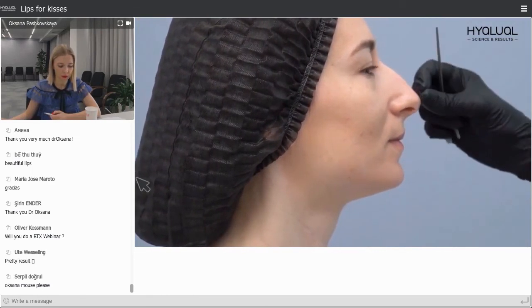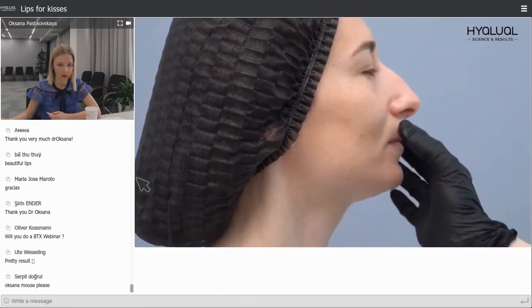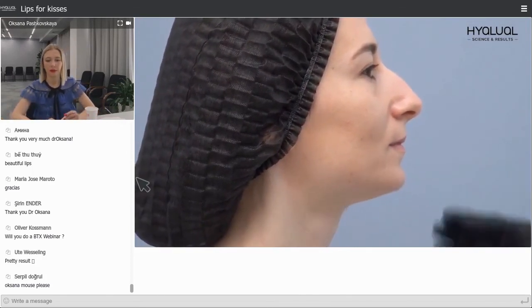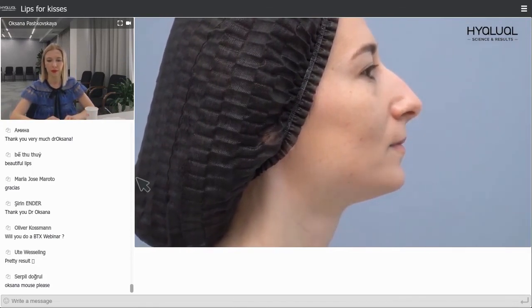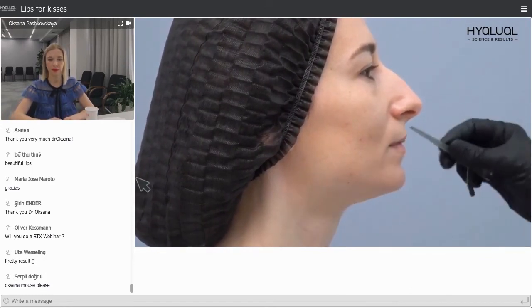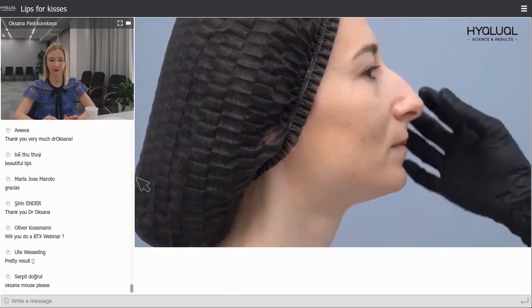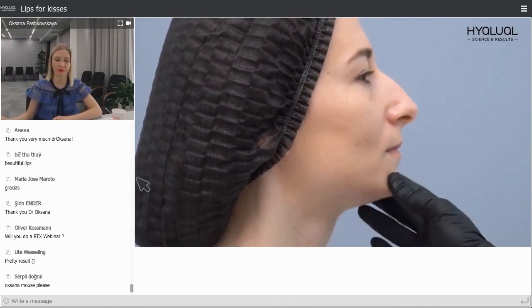Why do I pay attention to this angle each time? Because if we lead it to less than 90 degrees with injecting lips, it causes a duck lips effect. And also, when you treat the smoker's line, check the nasolabial angle to not decrease it much. Upper and lower lips correspond to each other. The tip of the chin we could make longer and the labiomental sulcus smoother. So we will get a more harmonized profile.